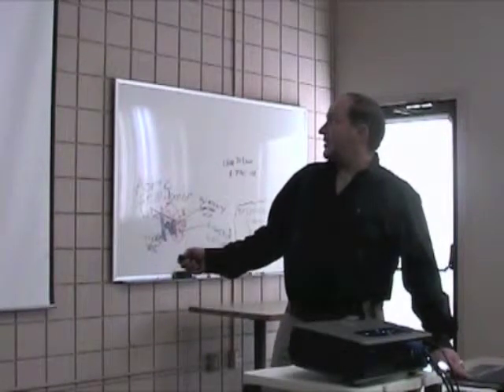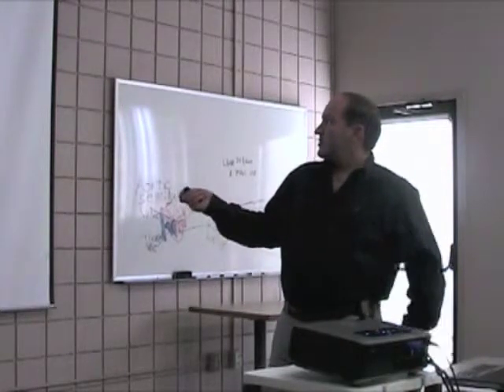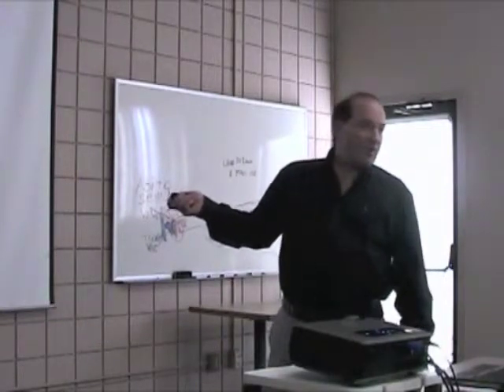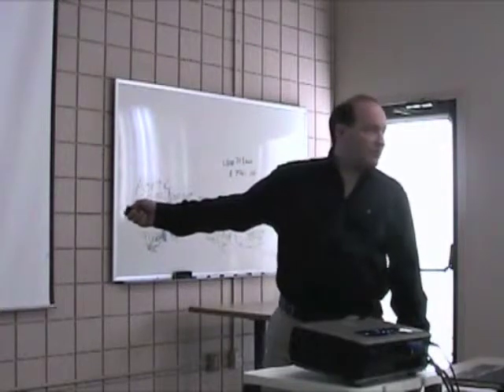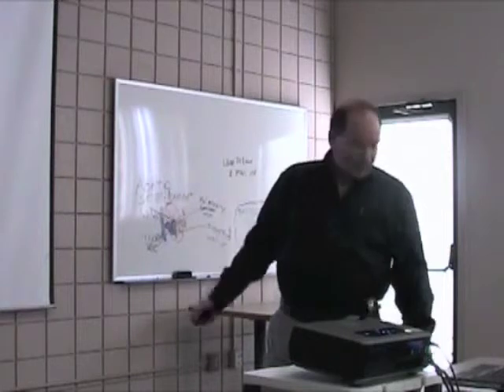This is a Hancock valve. This is a more modern valve, and I'll show you the one that we use today. Actually, it's not this one. This is a Bjork-Shiley valve. It's another valve that is no longer on the market because a lot of people had these put in the 70s and 80s, and then they had strut fractures. These things tended to crack, and so they took that off the market as well.